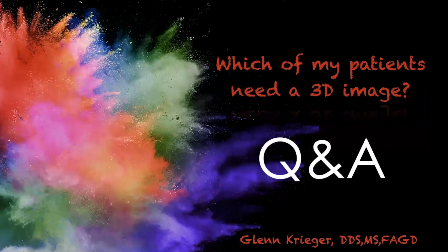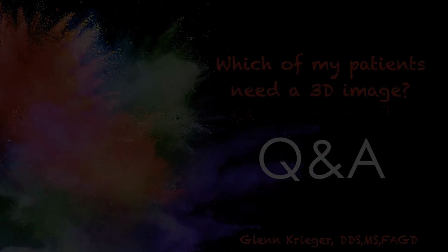And then had a couple questions about the different resolutions you took all your scans at. Would you mind quickly reviewing that? The resolution at which I take the scans? Yes. I mean, it's 0.3 is what I take for pretty much everything. It's a 13 by 10 for the typical adult patient. But again, I don't take it at high res. I take it as a low res image, or standard res. I wouldn't call it low res.